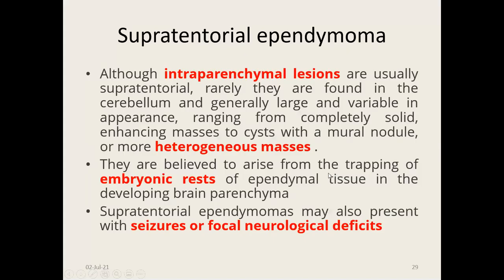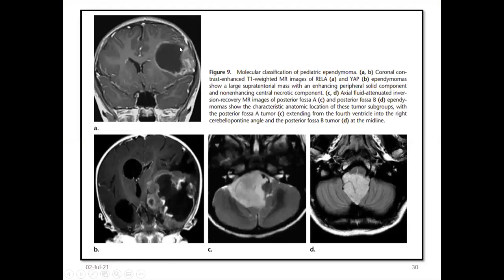Supratentorial ependymomas are mostly intraparenchymal lesions with heterogeneous enhancement, developing from the embryonic rest of ependymal tissue. Patients mostly present with seizures and focal neurological deficits. This is the RELA fusion parenchymal supratentorial lesion; this is the YAP1 fusion lesion. Group A tumors extend laterally through the foramen of Luschka; group B tumors extend toward the foramen of Magendie. All four molecular groups are illustrated together here.